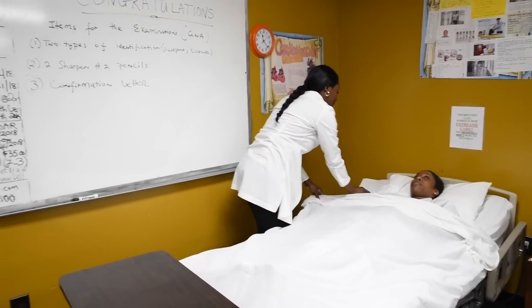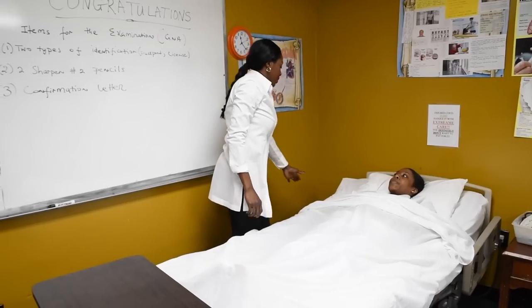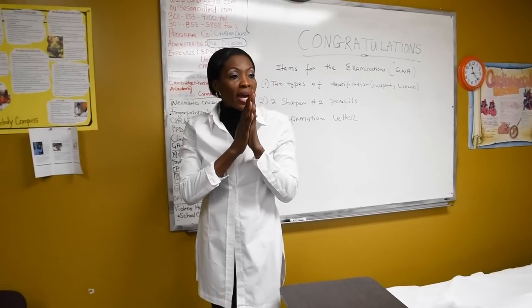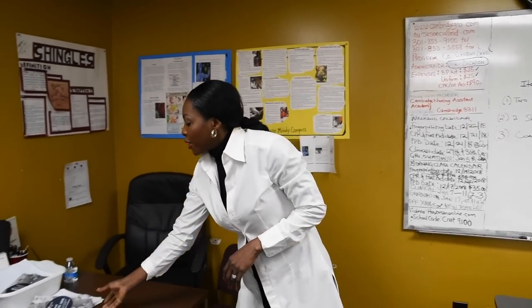This is your call light. Miss Nafisa, my bed is in the lowest position and I'm going to wash my hands, all right? Then you go to your next scale over here.